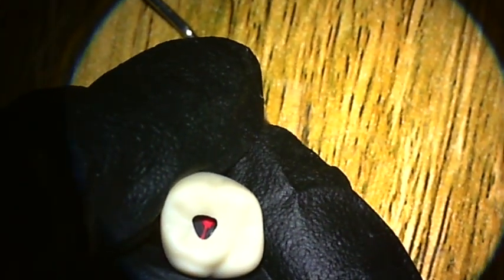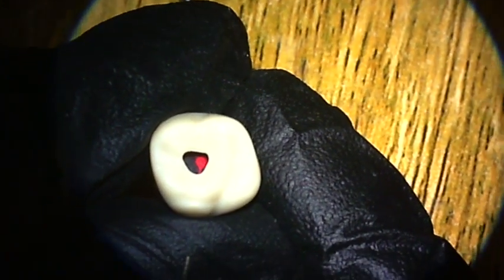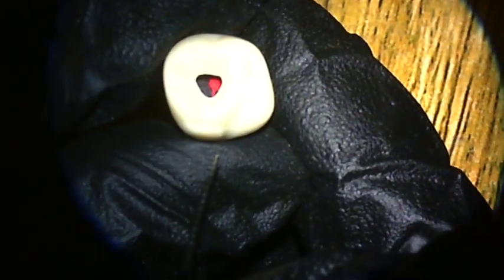Condition of the pulpal floor: you shouldn't be touching those orifices at all. This part, the red parts, should not be touched. Obviously no debris, so you should make sure that you thoroughly wash the cavity, leaving no debris at all, no dentin. And lastly, cavosurface margin and wall finish.